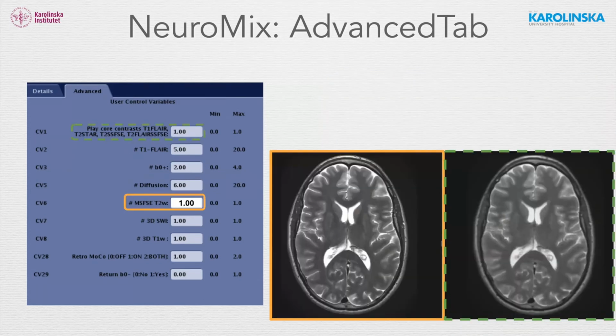We can also have a multi-shot T2-weighted FSE. Single shot is the robust workhorse, we think. But to the left here, you see the optional 45-second T2 you can have as a part of NeuroMix. You can extend the NeuroMix, still with one scan button push, by 45 seconds to also get this T2 multi-shot FSE or turbo spin echo, which is sharper but not motion robust.